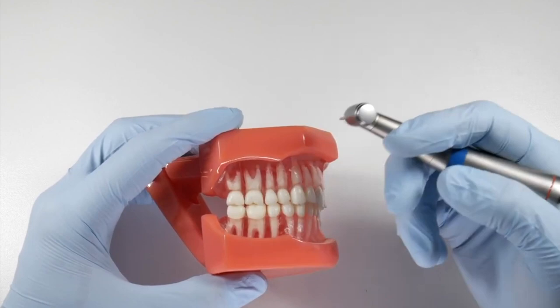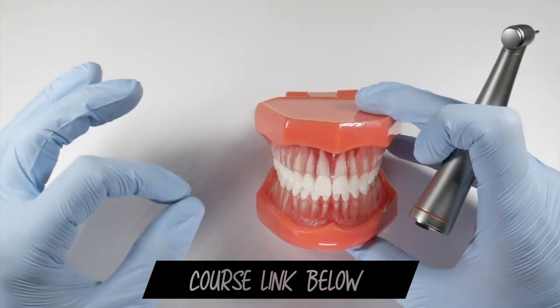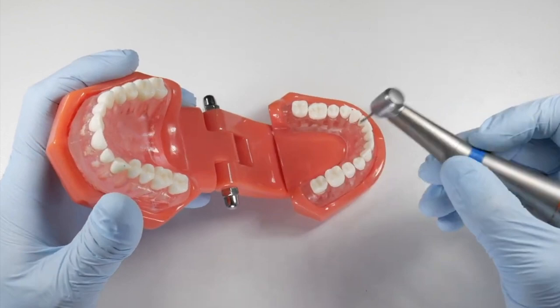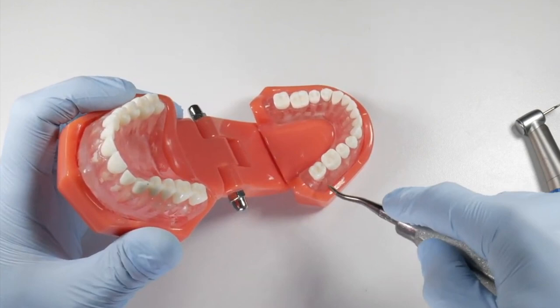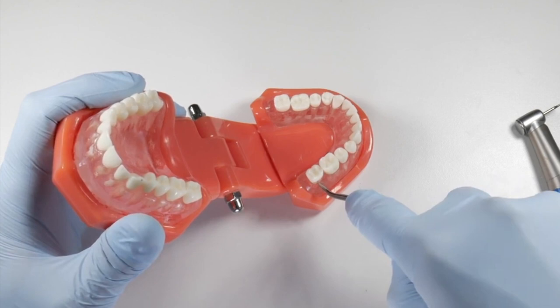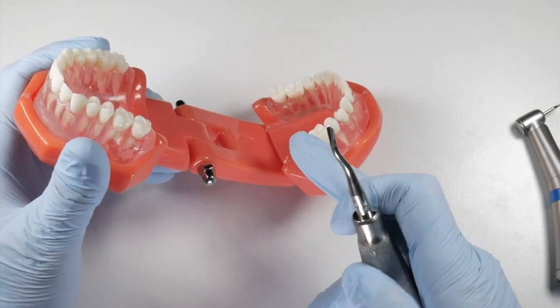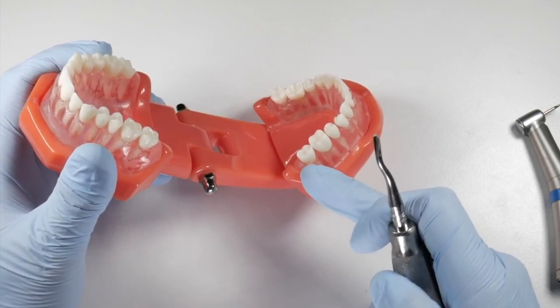Make sure you're completely through the tooth so you don't have to rely on your elevator to split it the rest of the way. The exception is on the mandible — you don't want to section completely through to the lingual. Section about two-thirds of the way, ensure the crown is off, seat your elevator as deeply as you can in your split, and rotate it gently towards one of those sides to split that tooth. If you rotate too high up or leave the crown intact, your forces generate along a different plane and you'll get a propagating crack that goes in the wrong direction.